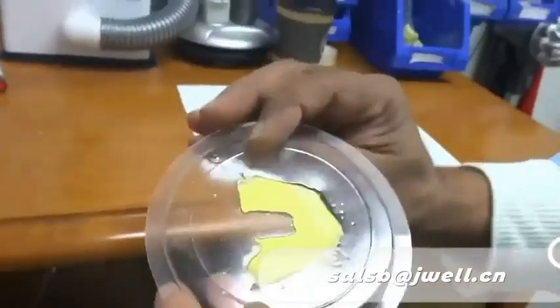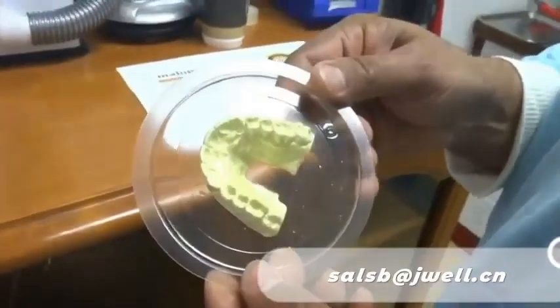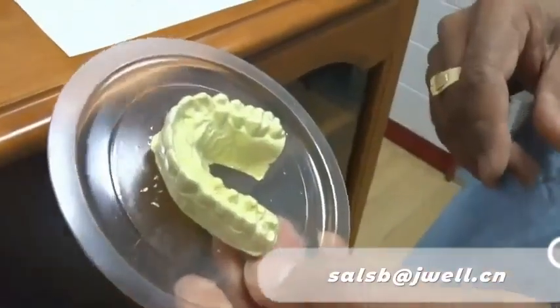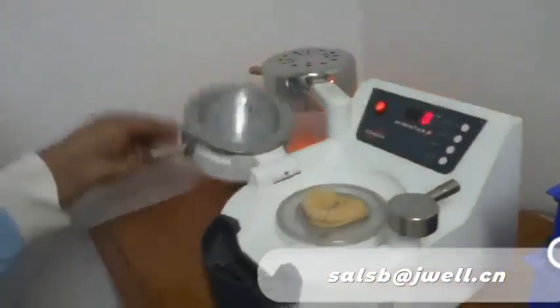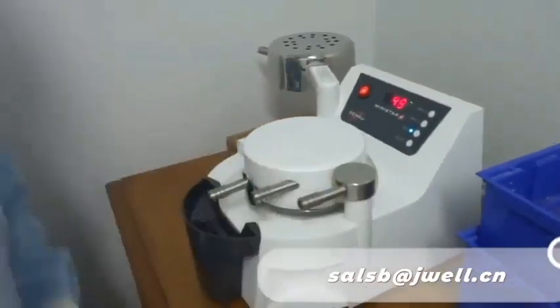This is how it comes out of the machine, like this. So once it comes out like that, we remove it from the machine, and we take it across to our trimming station. So you can hear the machine is now beeping, giving us a 5-second warning. So we close it like that, and then we come over here.